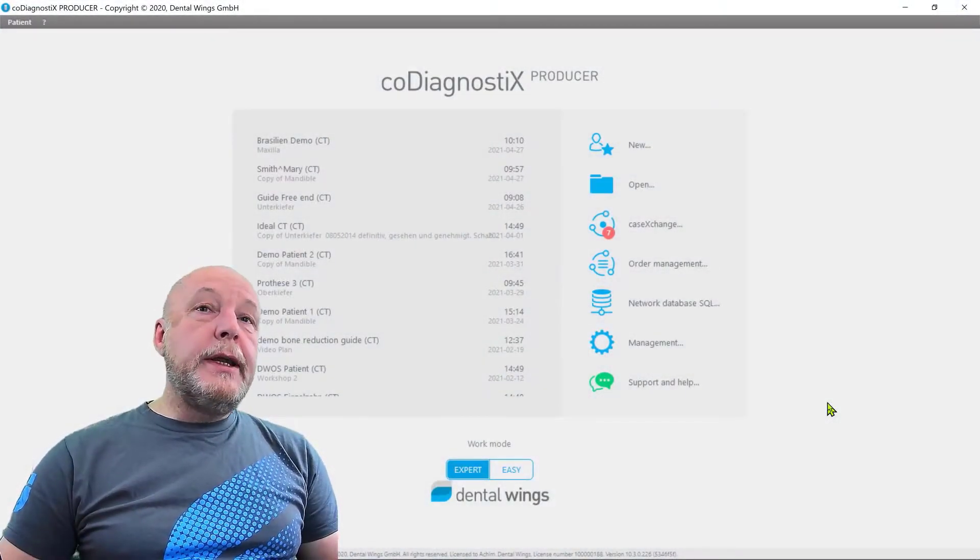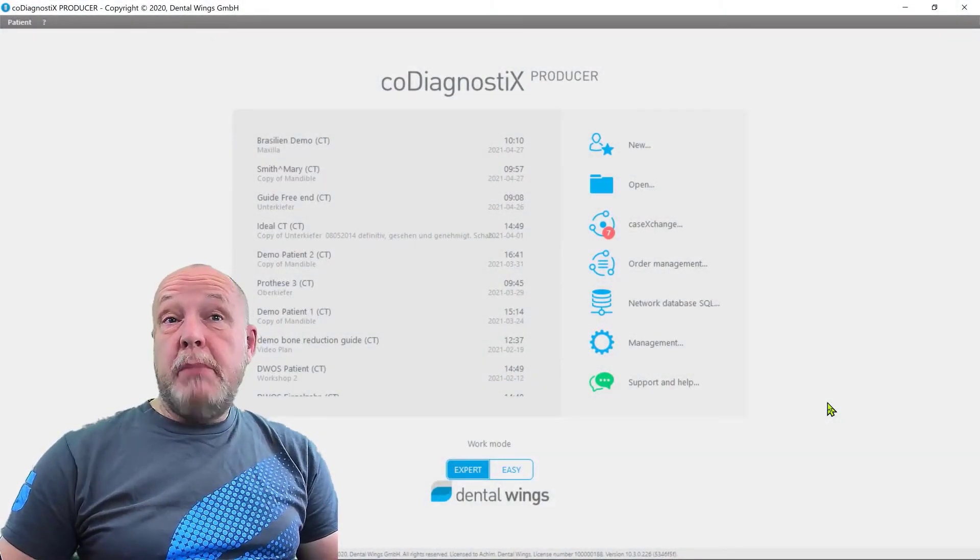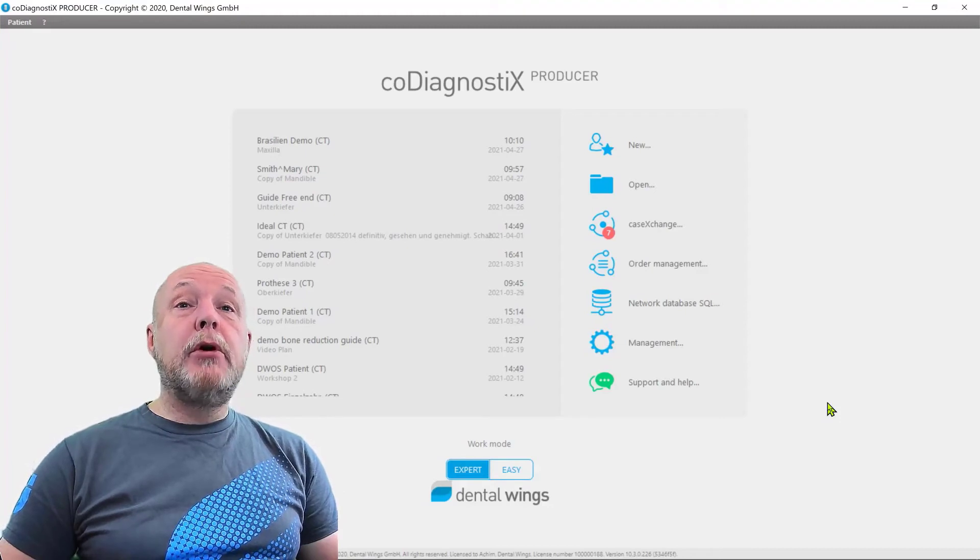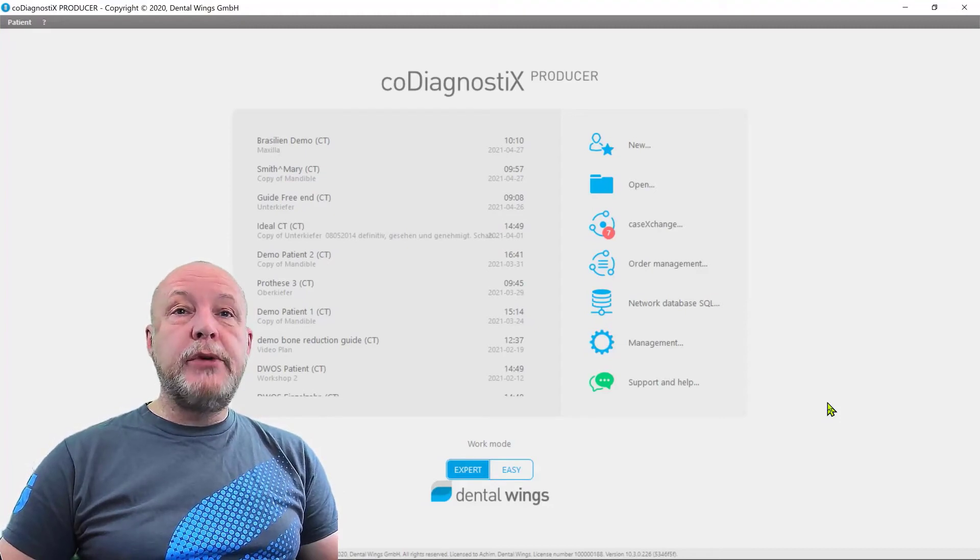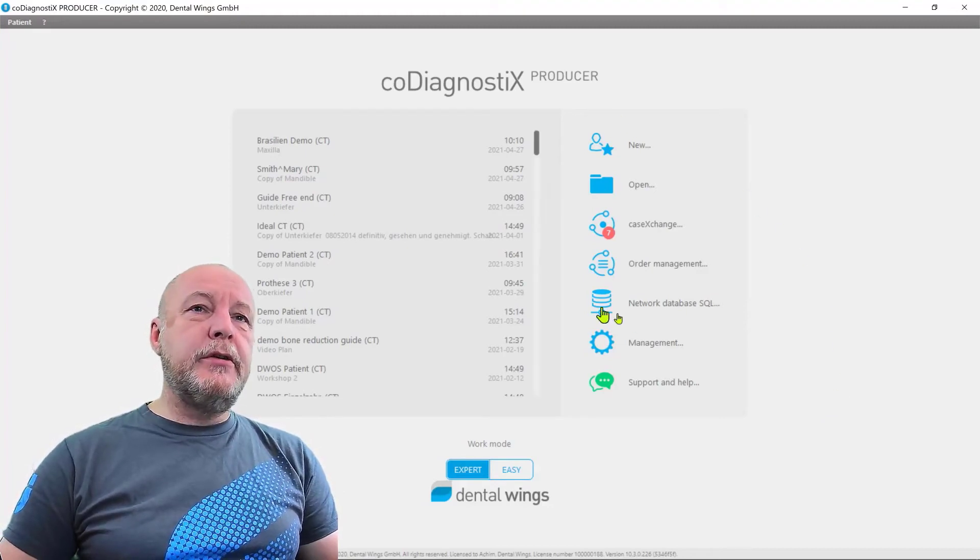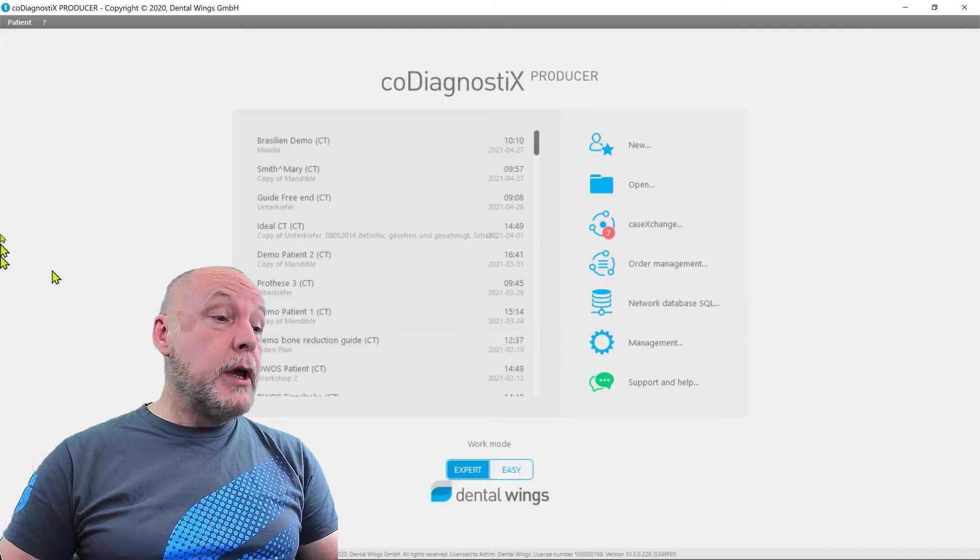If you want to delete a patient, maybe if you made a double DICOM import or whatever is the reason, we made it not too obvious. It's only possible on the starting window.